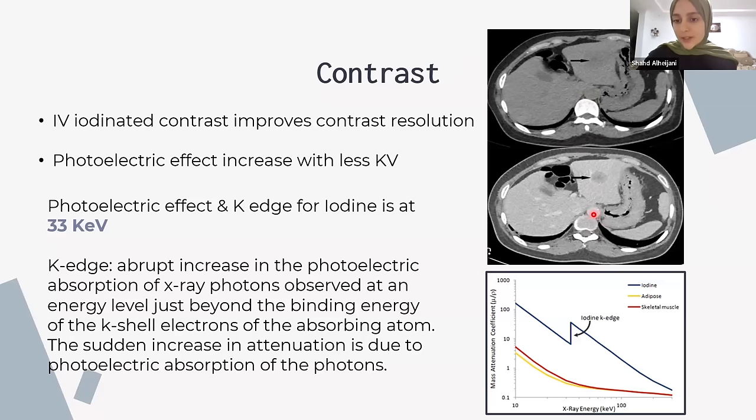But if the aorta is bright, if you look at the aorta and it's white, now aorta is basically blood. So blood is not supposed to look white. We said the bone has the highest attenuation. But if it looks bright like this, then the image has contrast. So here the contrast will help you visualize the structures better. For example, any hemangioma in the liver, any tumor, the tumor will take up the contrast. So it will appear bright. So yeah, that's the benefit of having contrast.